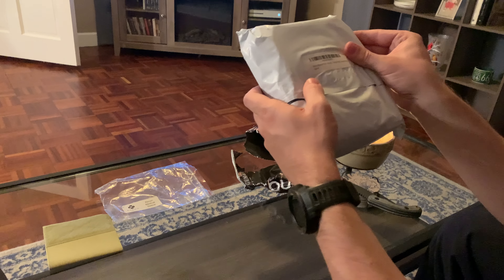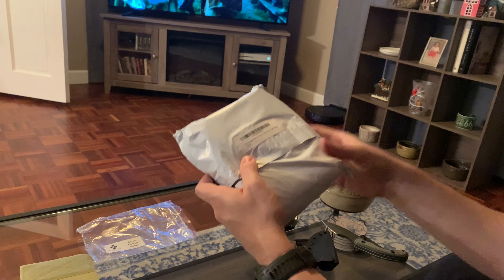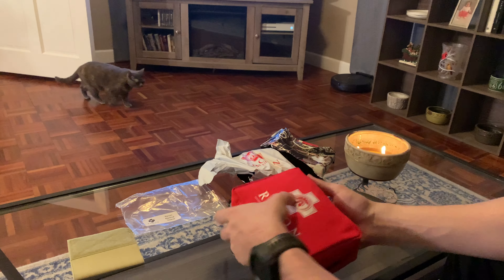First, we got a Recon Medical sleeve. I think this is actually for tourniquets — you can put this on your plate carrier or if you have any Velcro on your uniform. It's got the hook and loop on one side and soft on the other side, with a little sleeve. And we got the Recon Medical pack included — a tactical red canvas bag. Let's crack that open.